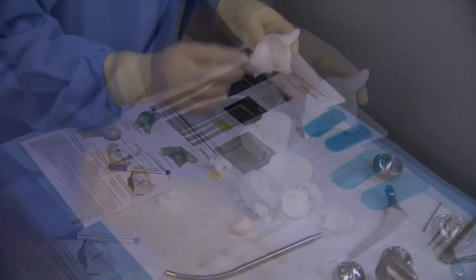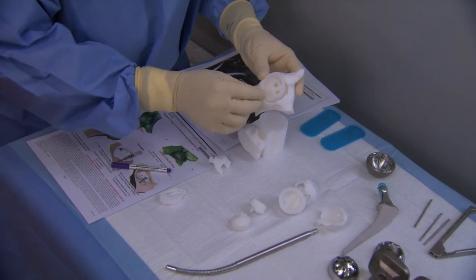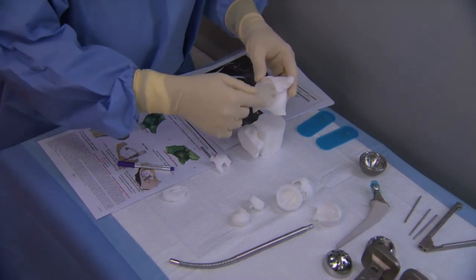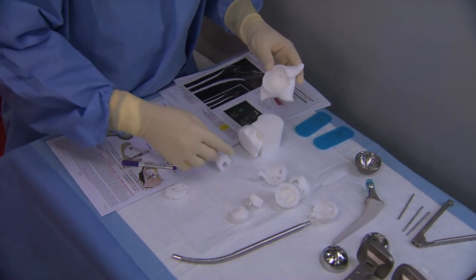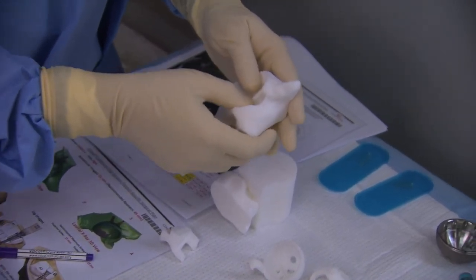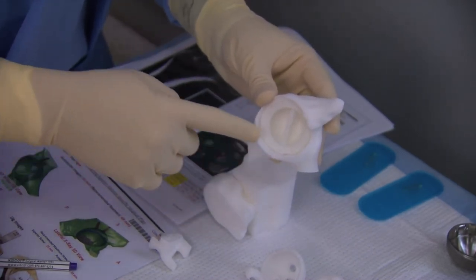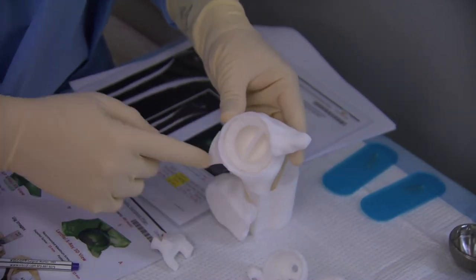Once we've done that reaming, we have an A3 jig that you can then again place into those central pilot holes. It also references the rim, and we're going to use that jig to see our ultimate cup placement. I'm going to take a marking pen and outline the osteophytes. This is the cup simulator jig, and this can actually show what our actual cup will look like sitting in the acetabulum, as long as we've positioned appropriately. In this particular case, there's going to be a lot of peripheral rim osteophytes that we'll need to remove.